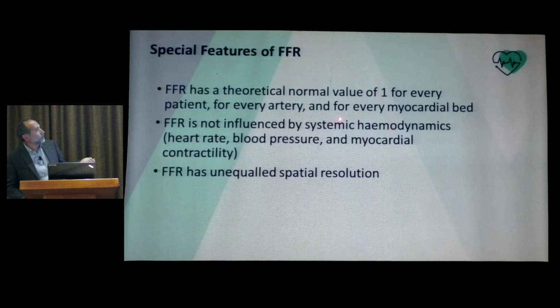So what are some of the features of FFR? We know why FFR is such a great way of assessing patients. Because every patient, every vessel and every lesion has a normal value, which is 1. It doesn't differ between patients, doesn't differ between lesions.